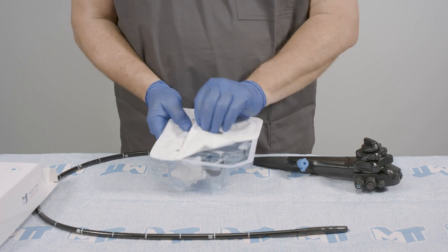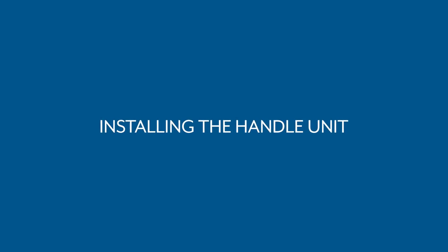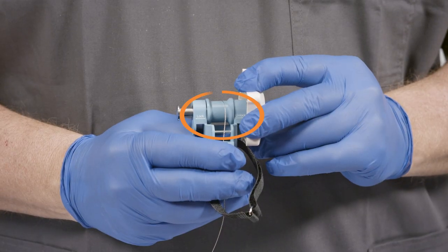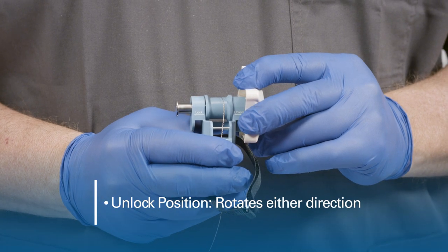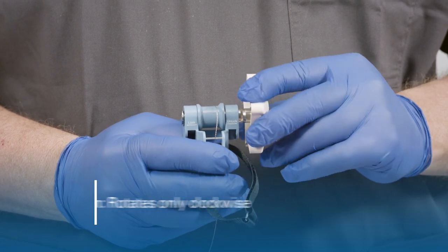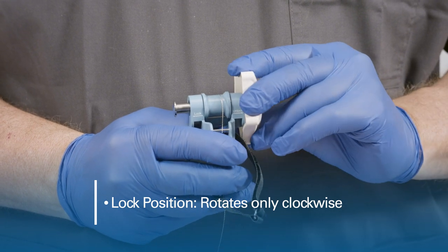Peel back the lid to gain access to the tray. Remove the handle unit from the tray. Notice the lock and unlock labels on the handle. Pulling the knob in the unlock direction allows the handle to rotate in either direction, while pushing the knob into the lock position will allow the knob to spin only clockwise.